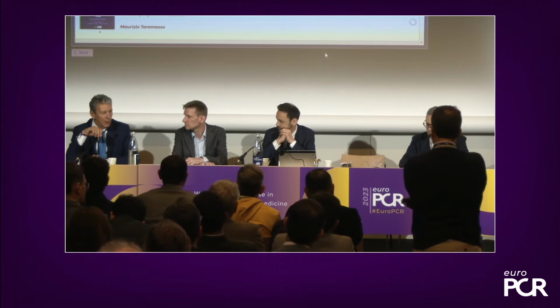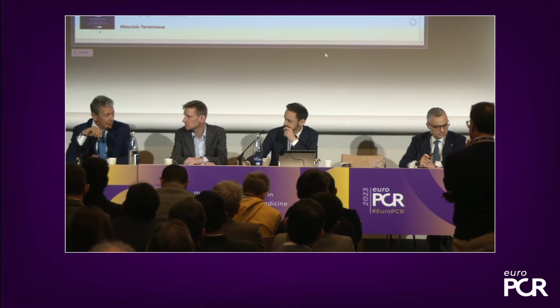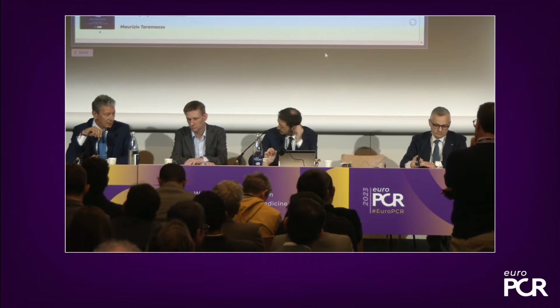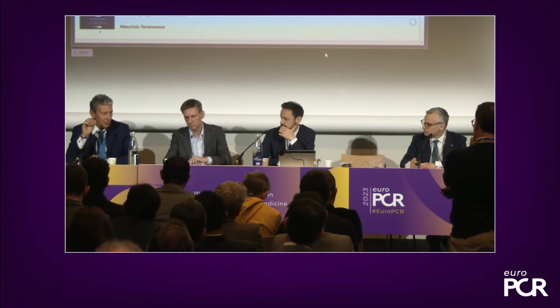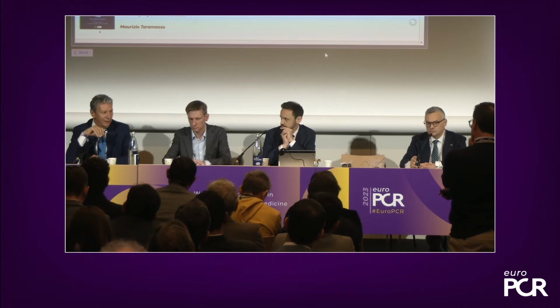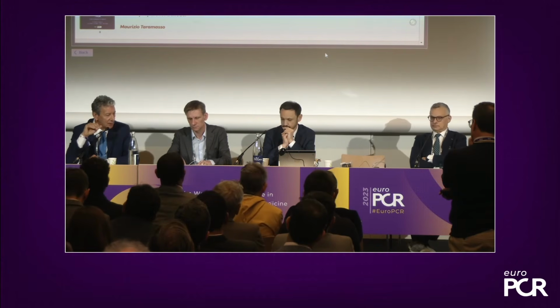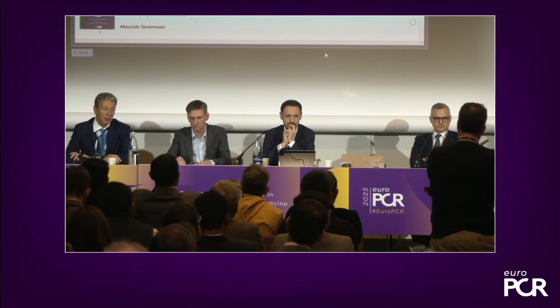Maurizio, now we did it, but recently we are checking with the echo. Or with echo, yes. With echo is fantastic because you see if you have bleeding, if you have pseudoaneurysm, the details of the echo are really very good. If you develop an expertise with the echo, it is fantastic, and you save contrast.